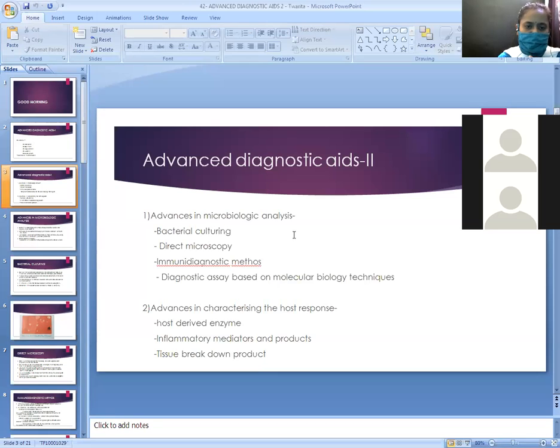If there is a 2-wall or 3-wall bony defect, then you are going to fill the defect. During the surgical procedure, you will open that periodontal area and fill that region with the help of a bone graft. Then you need to evaluate whether your bone graft has taken, whether it is there in that region properly, and whether bone regeneration is occurring or not. For that purpose, you need to take radiographs in proper position. Every time you have to maintain the patient's position, and a proper positioning device should be there.